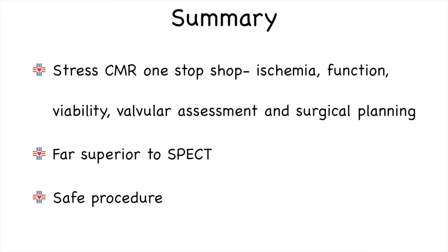In summary, stress cardiac MR is a one-stop shop assessment for ischemia, ventricular function, myocardial viability, valvular assessment, and also surgical planning. It is far superior to SPECT and is a safe procedure if adequate preparation is taken in selecting the patients and monitoring the patients well during the procedure.